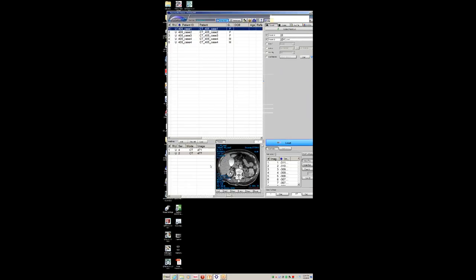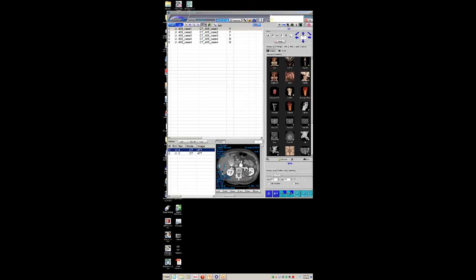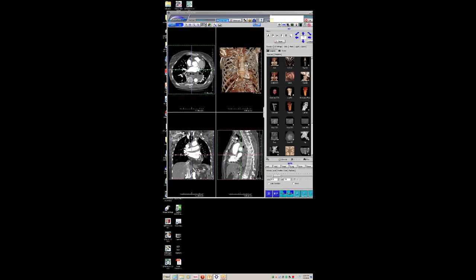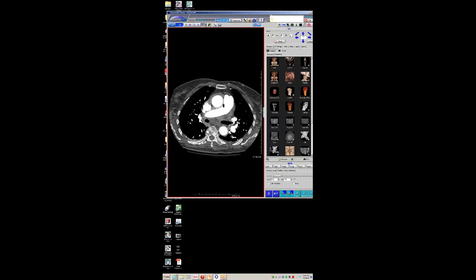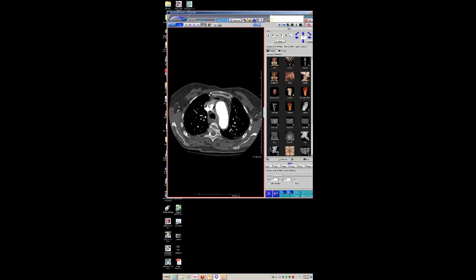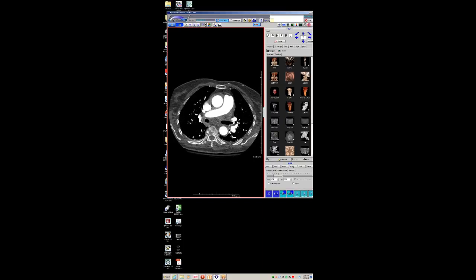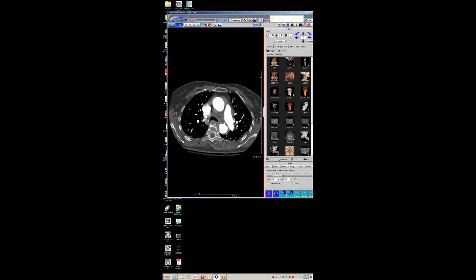Seth, would you like to start this week? Yeah, sure. All right. So this is an interesting case I had yesterday. Reading things in a vacuum — this patient was sent to us with the history of chest pain and possible dissection.